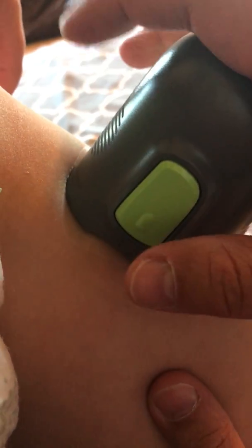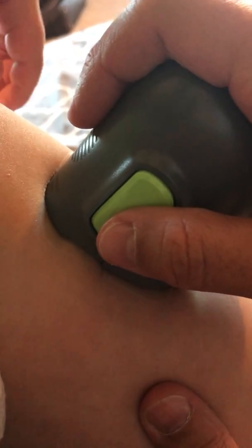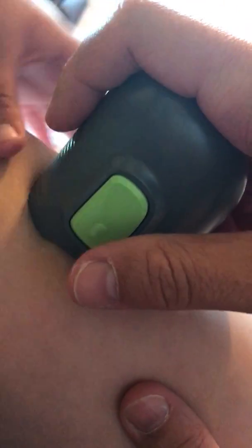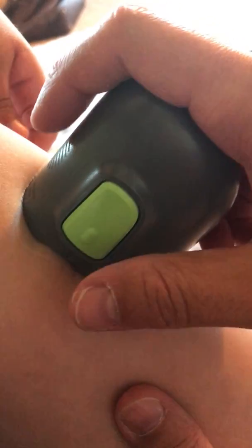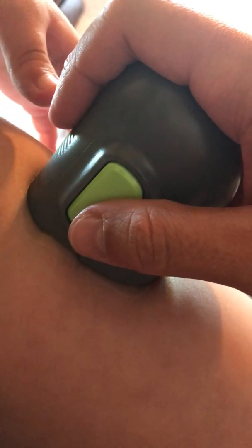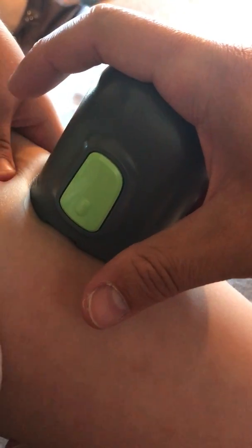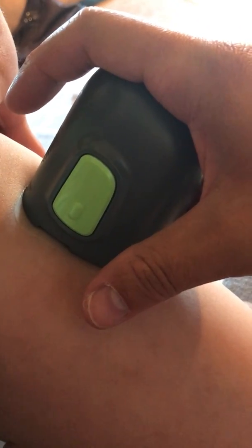The needle side goes in the top, and it just perfectly fits, basically, right on the Band-Aid Tough Pad. You put your finger on that fingerprint up there. There's a green button on either side. And usually, before I do it, I count to 3, and then we do it. Then you press both green buttons on either side at the same time, and let go. And then you're supposed to wait 10 or 20 seconds just to make sure it's in there.